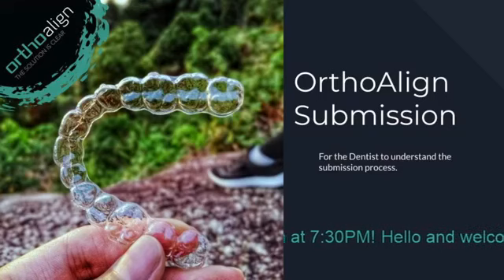Over here at the back, we can see that this is not quite normal. This is an intraoral scan, but you can see how it's not captured 100%. The last molar is not captured fully, and there are some artifacts over here. Okay, so inside your intraoral scan, you definitely don't want any of these surfaces, as this can cause problems, especially on the gingival part, and also for the fabrication of the aligners.